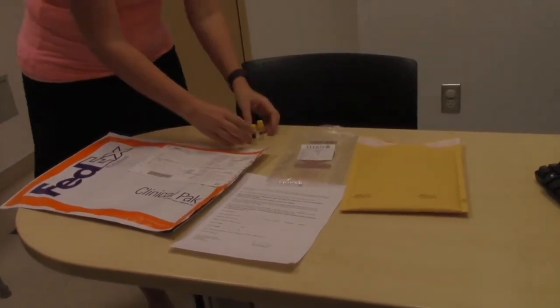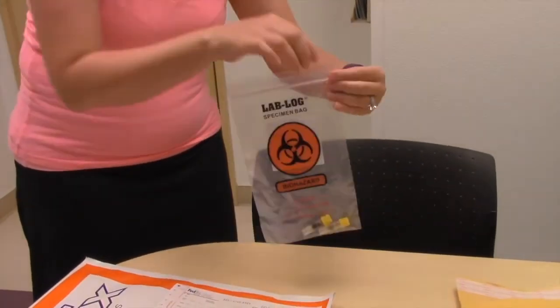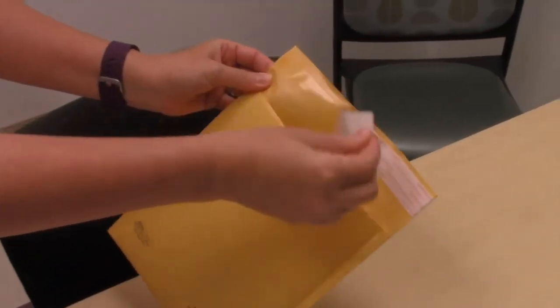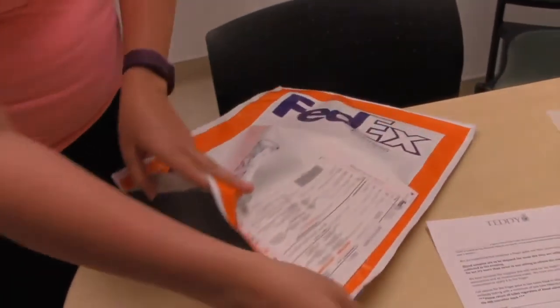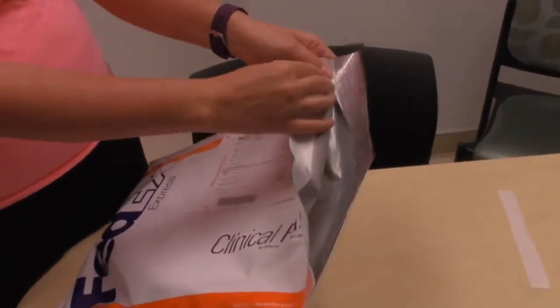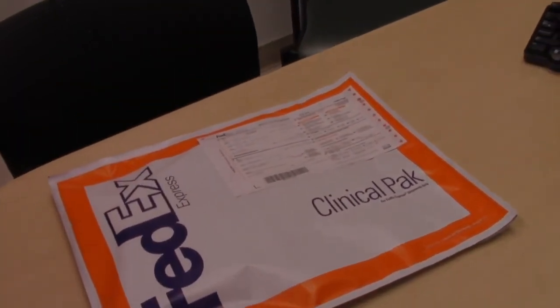Finally, make sure the tubes are capped tightly and put the tubes of blood in the biohazard ziplock we have provided. Roll the ziplock bag and place it in the padded envelope. Place the padded envelope in the large FedEx envelope. Please complete the blood collection form and place it in the large FedEx envelope as well. You may take the sample to a FedEx Dropbox or contact FedEx to have them pick it up at your house using the schedule of FedEx pickup instruction form we have provided.